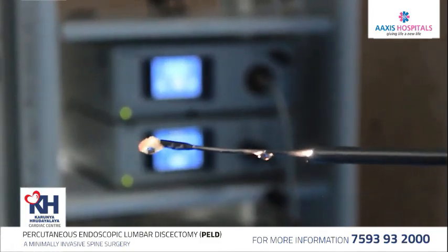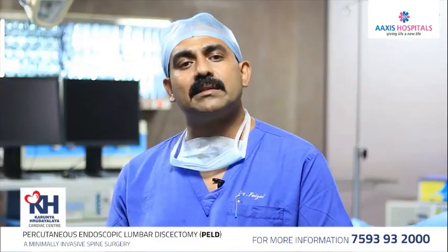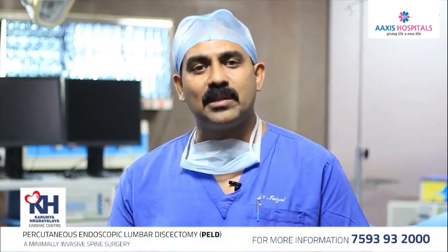and we could finally get the nerve roots decompressed. On table we could get the feedback from the patient that his leg pain had decreased, and we made him cough. It's called the Valsalva maneuver, and the pain was not radiating anymore down the leg. So that was the end point of the surgery.